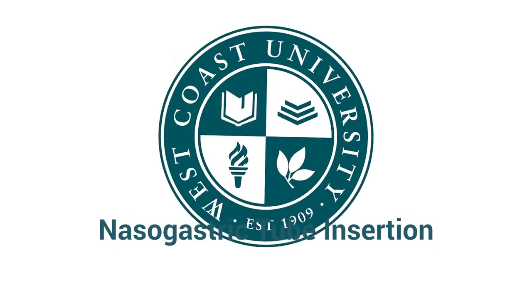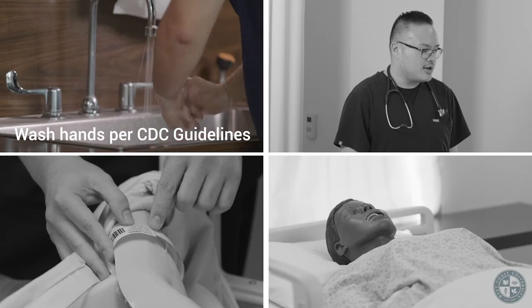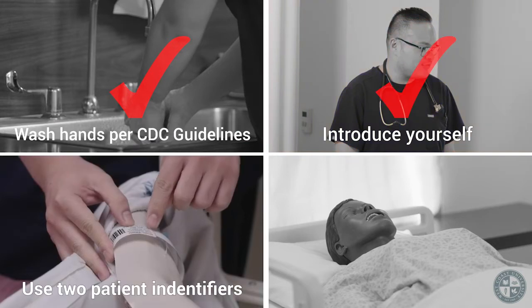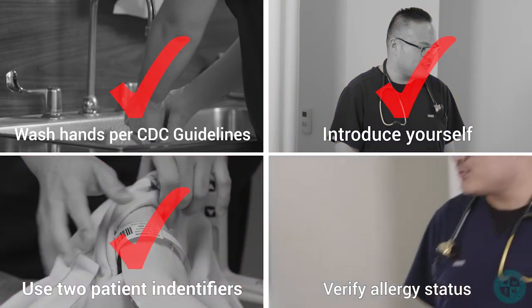Nasogastric tube insertion. Before beginning this procedure, always perform the following steps to ensure patient safety: wash hands per CDC guidelines, introduce yourself, use two patient identifiers, and verify allergy status.